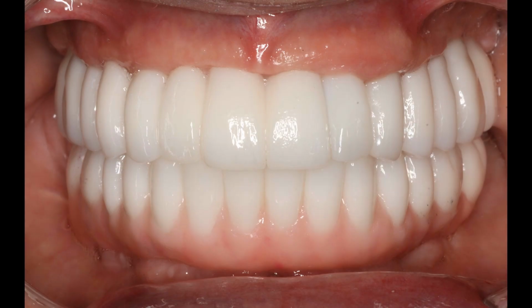So here are his final restorations, and he's one of our patients that wanted to go as white as possible, so that's why you may need sunglasses to look at this picture. But the main thing I want you to see here is that his upper arch, there's no pink. We've got some semblance of a papilla between the teeth. And on the lower arch, he had lost enough bone that he had to have some pink zirconia down there. But all in all, an amazing case.